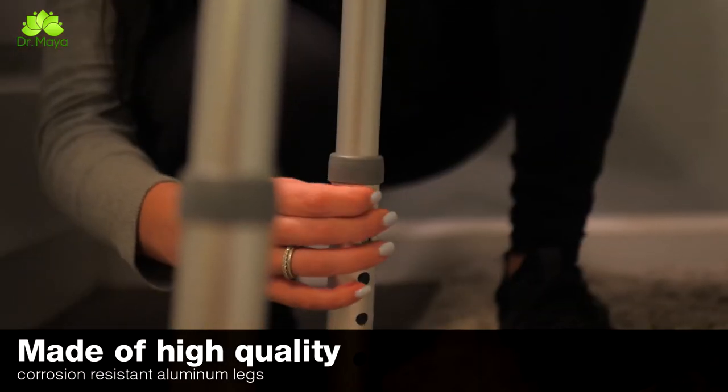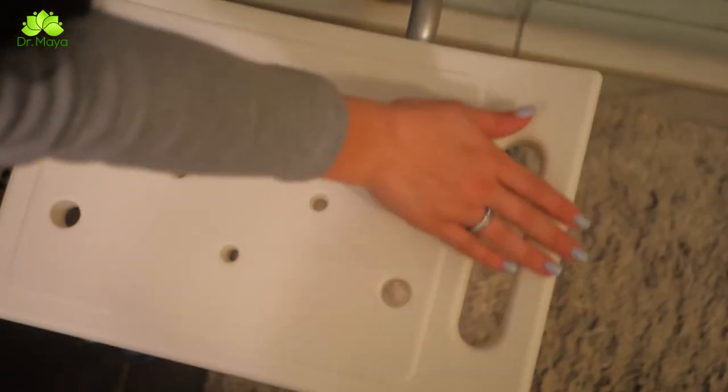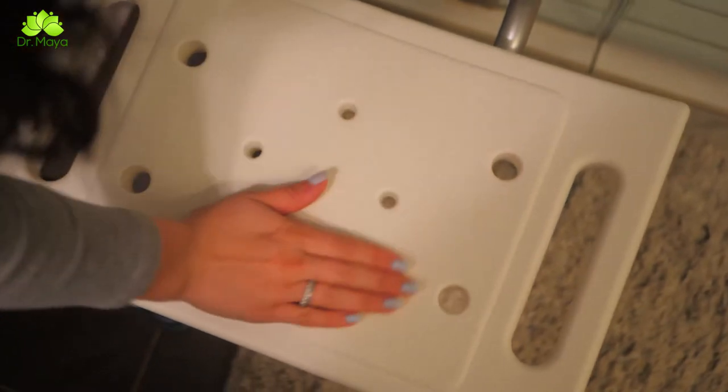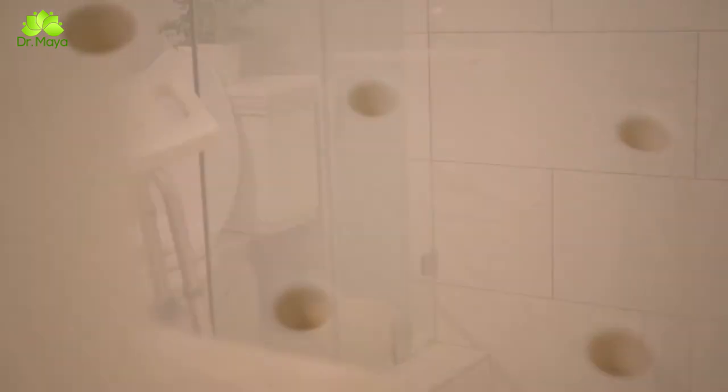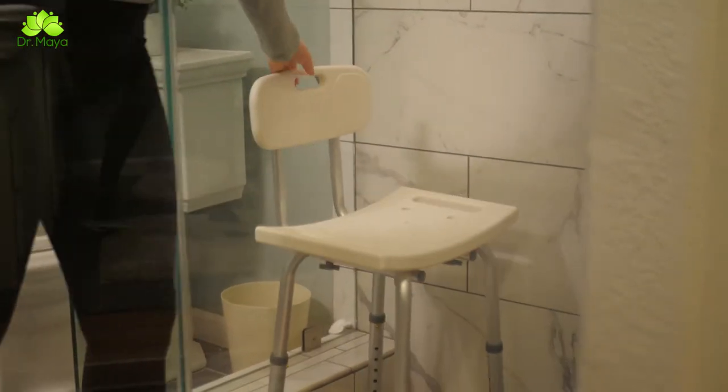The legs can be lengthened and shortened to accommodate various heights. The wide seat and backrest feature drainage holes and anti-slip rubber feet for added security and comfort when sitting for an extended period. The Dr. Maya bath chair is especially designed to fit small or narrow tubs, so even if you have very limited space, you still get the support you require.